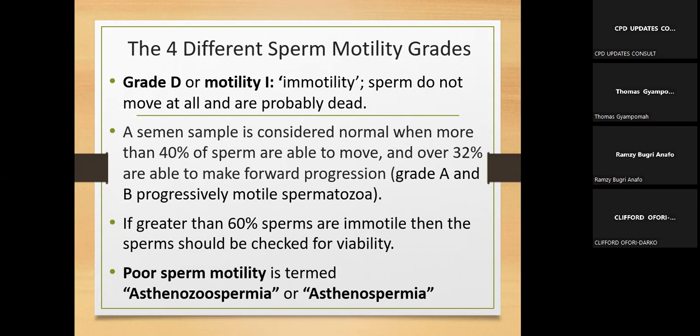All right. As we move along and get to the latter end, when we are dealing with pathologies in sperm counting, then you can put all of these things together. For example, a certain sample could have reduced motility. That same sample could have reduced morphology. And we said abnormal morphology is terato, and abnormal motility is also astheno.